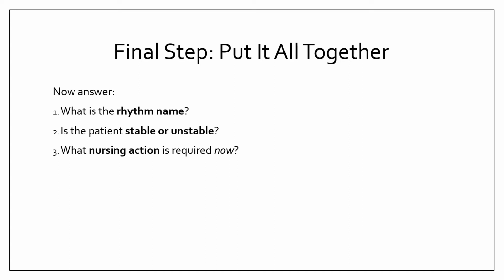Another question, what nursing action is required now? This is an NCLEX priority question. Possible actions might include continue monitoring, obtaining vital signs, check labs or medications, notify the provider, or prepare for emergency intervention.